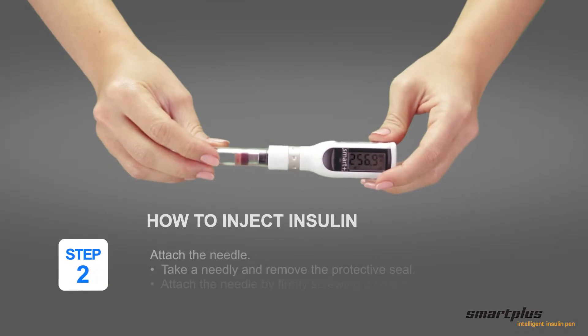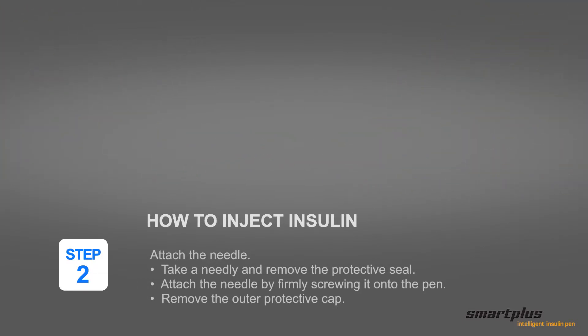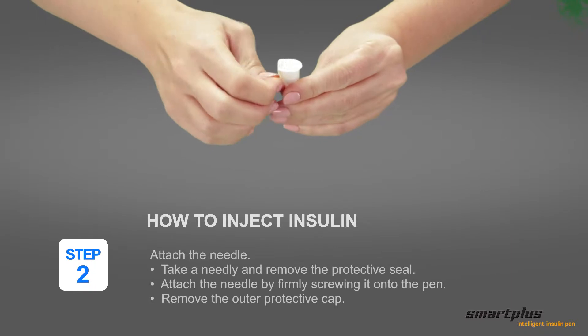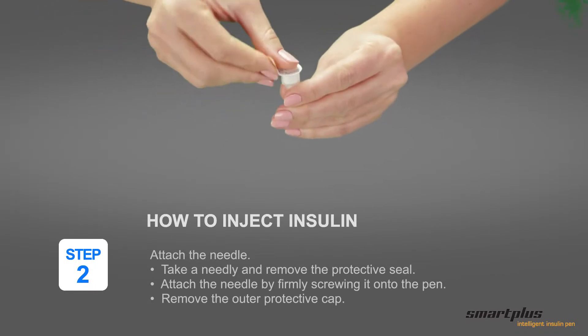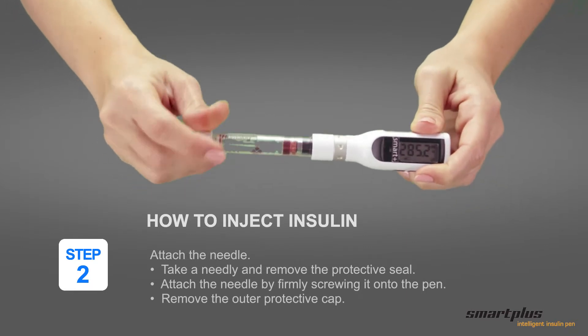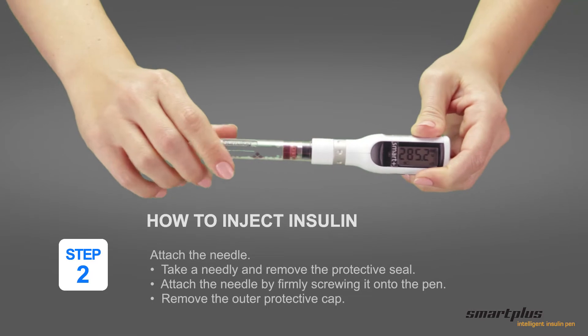Step 2: Attach the needle. Take a new needle and remove the protective seal. Attach the needle by firmly screwing it onto the pen. Remove the outer protective cap.